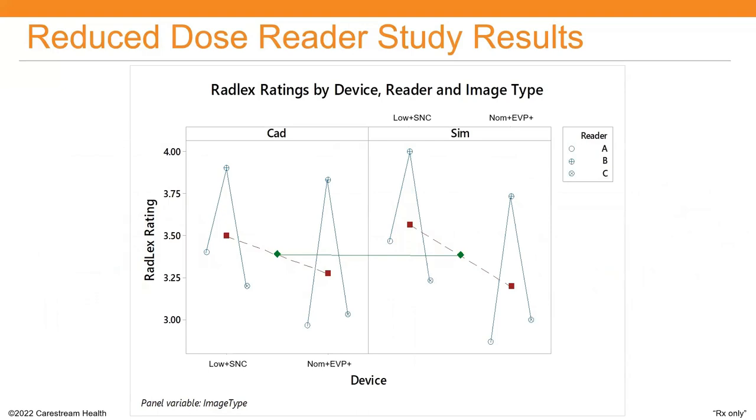From this chart, we observe that radiologists respond consistently regardless of image type, and on average, the reduced dose images with smart noise cancellation are consistently rated higher in diagnostic quality.